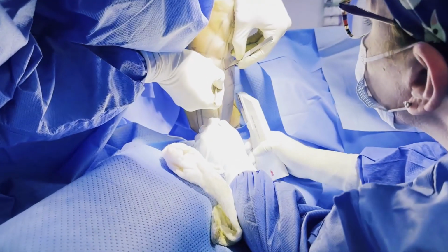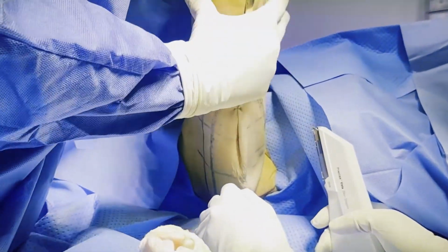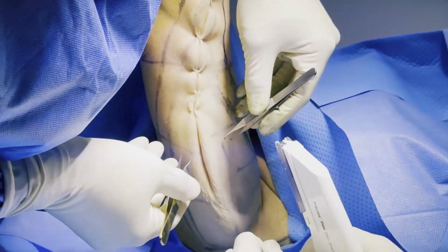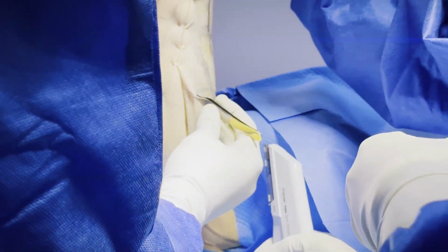So what we're doing now is called tailor tacking. We're just fitting that skin to a new contour that we created with the fat removal. So we're just checking our markings.